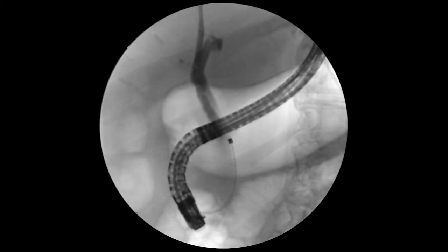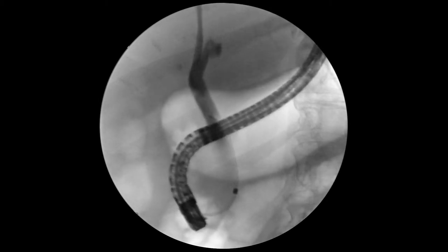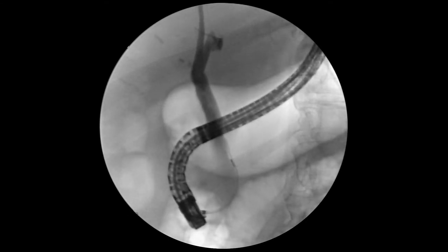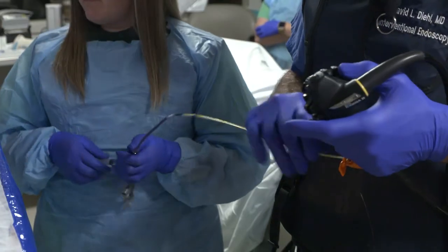You can see the entire bile duct from the upper to the lower is dilated. Keep injecting. Save a picture, please. Thank you. Okay, we'll take this stone retrieval balloon.